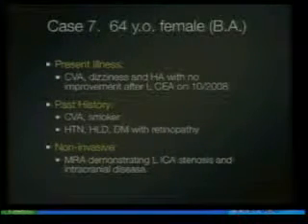we took about 2 months ago, if someone can pull those up, you can see a lesion in the common carotid, which looks like where the cross clamp was placed. And then you can also see a lesion up above that in the internal.